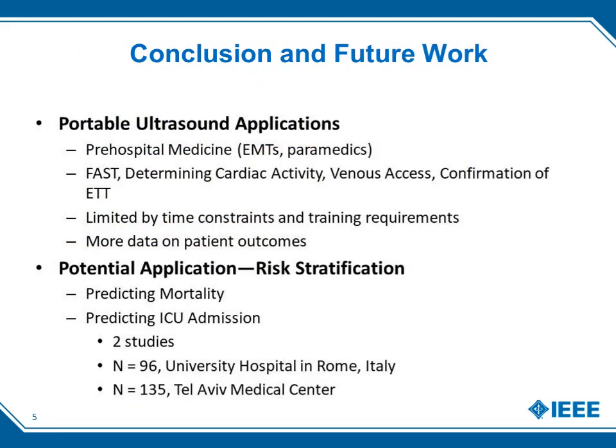Portable ultrasound has some interesting applications in pre-hospital medicine, which involves EMTs and paramedics who care for patients en route to the hospital. These include FAST exams, which detect blood or fluid in the abdomen, determining cardiac activity, and differentiating asystole and pulseless electrical activity from pulseless VTAC or ventricular fibrillation, ultrasound-guided venous access, or confirmation of endotracheal tube placement. These are all things that are possible with portable ultrasound.